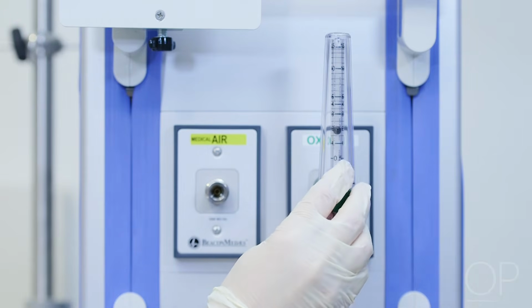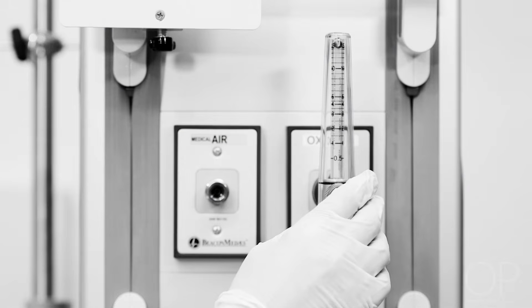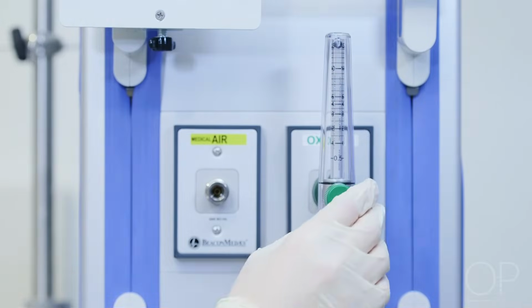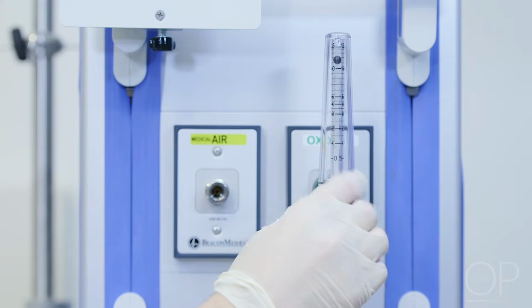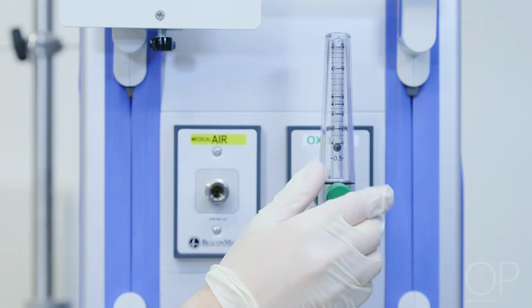The use of flush rate oxygen delivery, which is the maximum flow obtained by fully opening standard oxygen flow meters, is being recommended for pre-oxygenation in adult patients. The safety of this approach, with rates that may exceed 40 liters per minute, has not been established in pediatric patients and is not currently recommended.